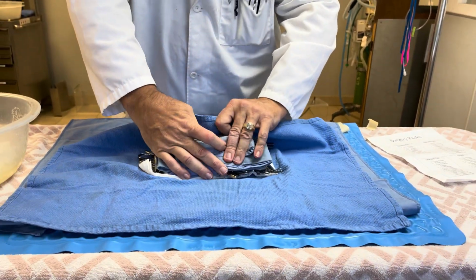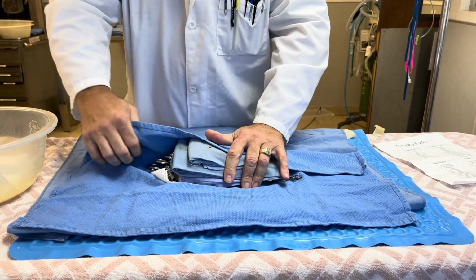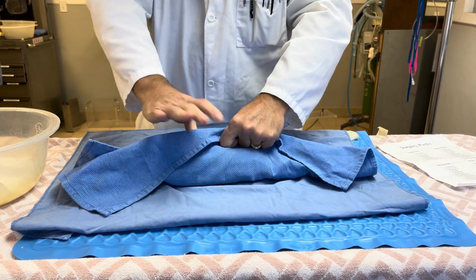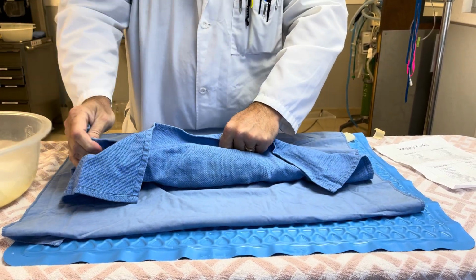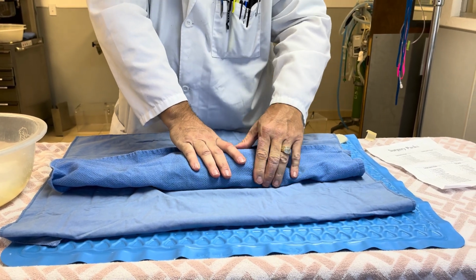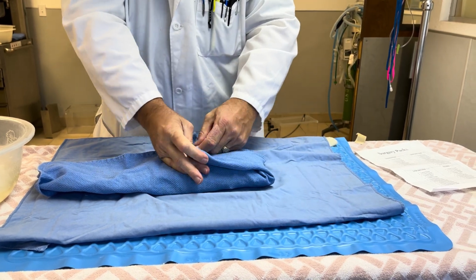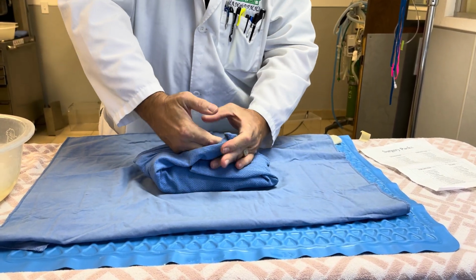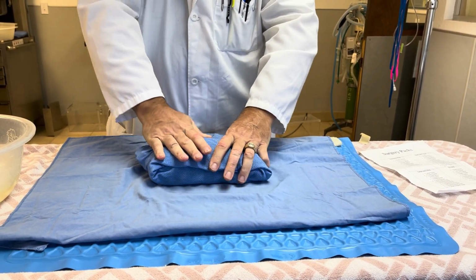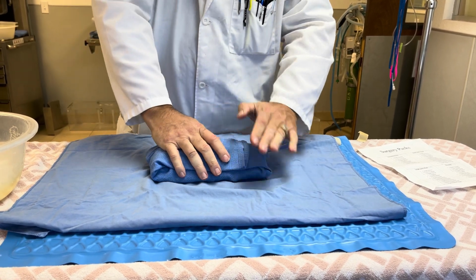Now, the key to the wrap is getting it tight. So the first one that you pull from your side, there's not really much you can do there, but you want to make it tight when you pull it from the other side, okay? Really super important. The reason we're on the spay hook is to keep this flat so there's nothing sharp sticking out and poking us. And then fold this over and that over like that. This is not anything in particular other than the way I showed it. There's no special reason to fold it any other way than that, okay?